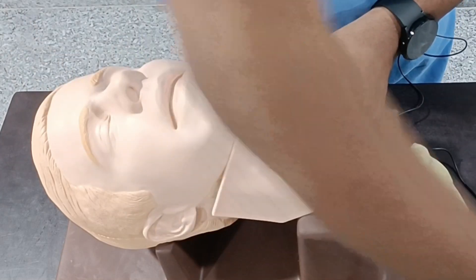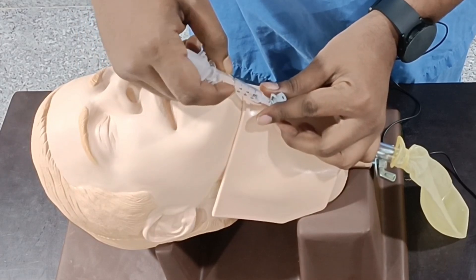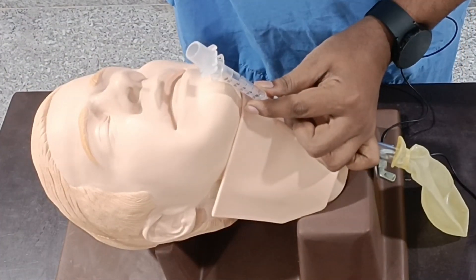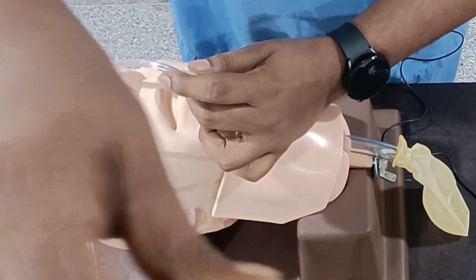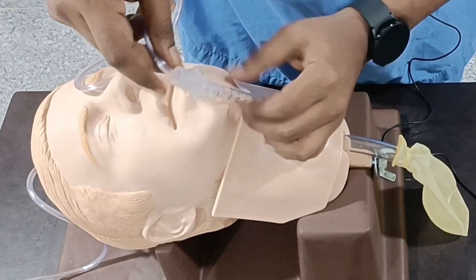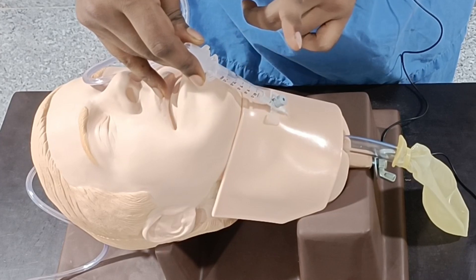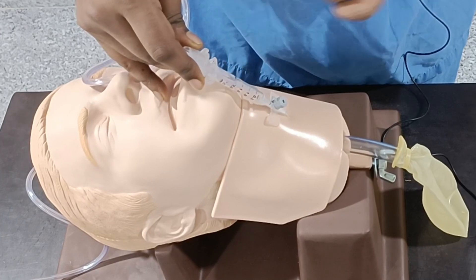Following insertion, we connect a second syringe which has an outlet valve, along with the ET tube connector. To the ET tube connector we attach the O2 airflow tube, which is connected to the O2 source. O2 is then delivered by occluding the outflow for a count of 1, 2, 3 and then releasing it, repeating this cycle for inspiration and expiration.